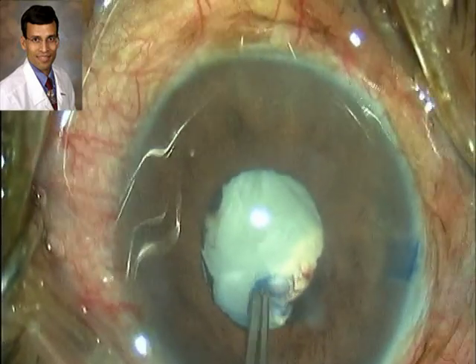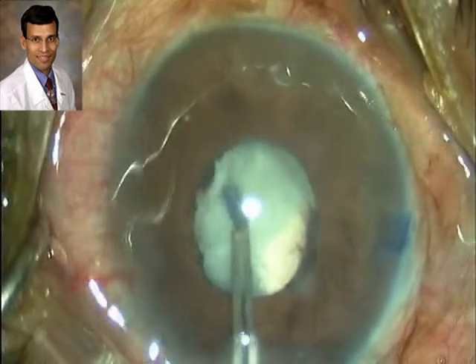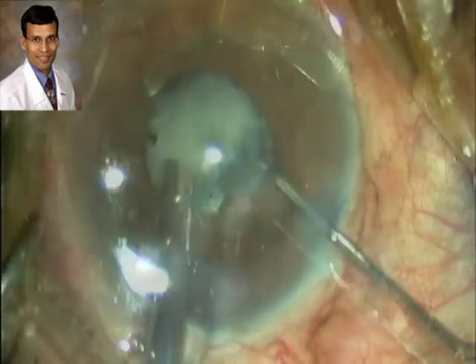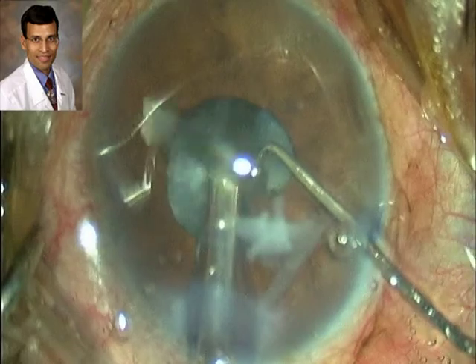And this capsulorhexis may have to be performed exactly at the pupillary margin in cases of not so big or enlarged pupils. Once we have an adequately sized pupil and a good capsulorhexis, the rest of the surgery is not particularly difficult as compared to other surgeries.